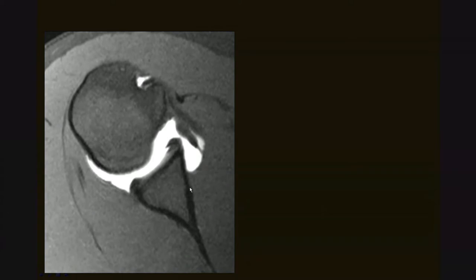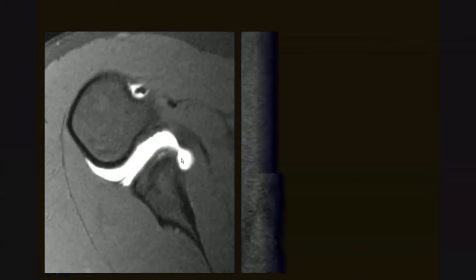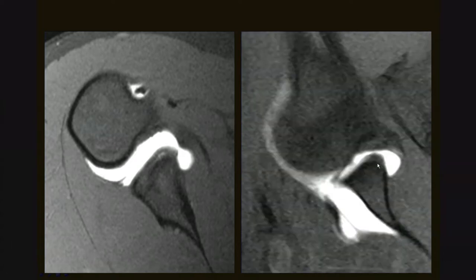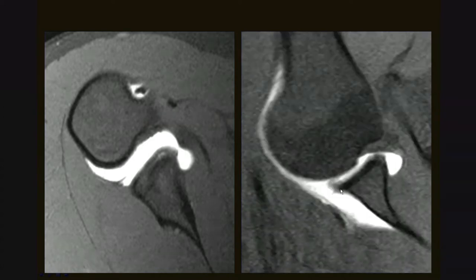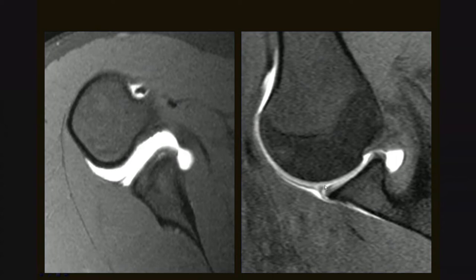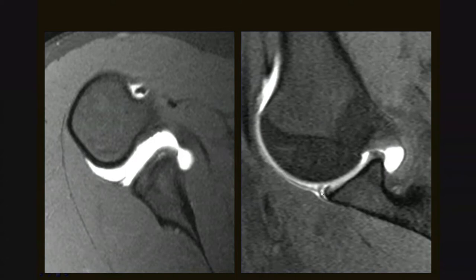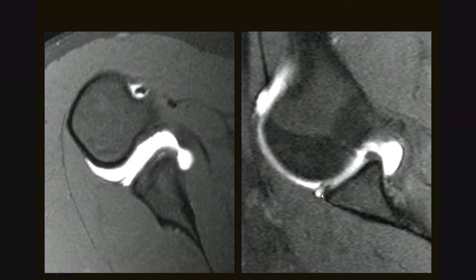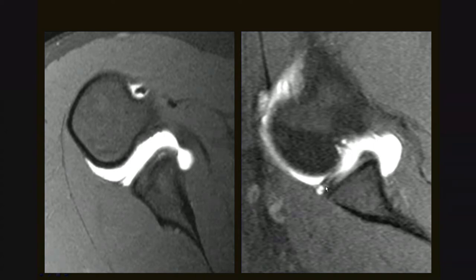Here's another example of a labral tear — this is an arthrographic study. MGL, subscapularis, biceps tendon, anterior labrum — it looks normal on this particular slice. Then a little bit of undercutting, then more undercutting where no normal sulcus should exist. On the ABER images, here's the lesser tuberosity, the biceps tendon in the groove, the greater tuberosity, the articular surface of the rotator cuff. As we continue down, here is the anterior labrum, here is the IGL attaching to the labrum, here is contrast in the tear, and here is a paralabral cyst. Fluid has passed through the tear into this very small extra-articular location, representing a finding pathognomonic for an adjacent labral tear.